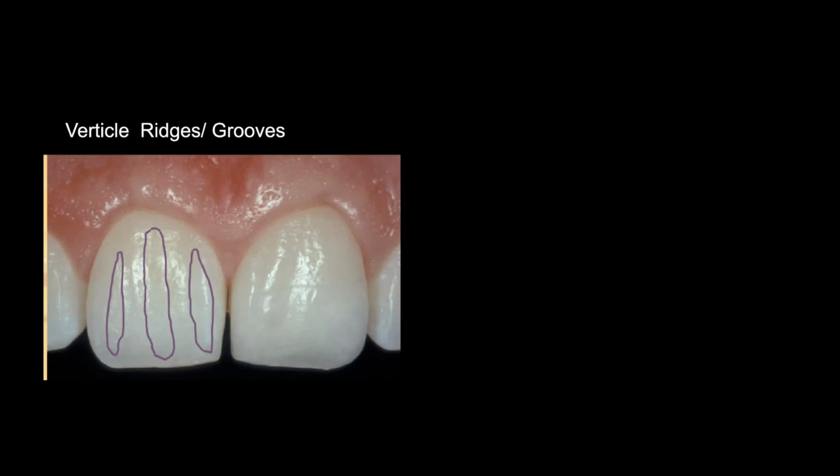White looks a lot brighter if you put it next to black. Blue looks a lot bluer if I put it next to a contrasting color, like maybe a yellow or a pink, right? Things that make things stand out to us. Well, it's the same with the surface topography. If I want that ridge to stand out, it's not always about adding the ridge. Sometimes it's about taking away what's next to it.